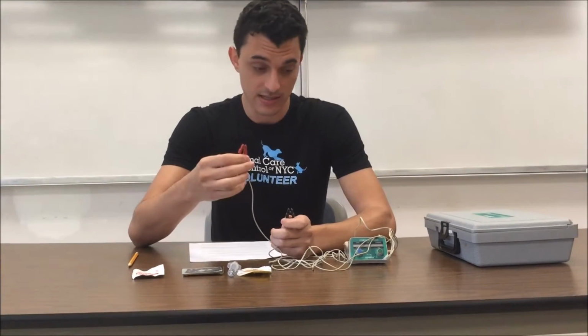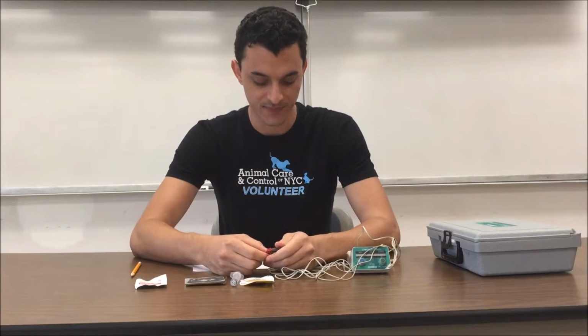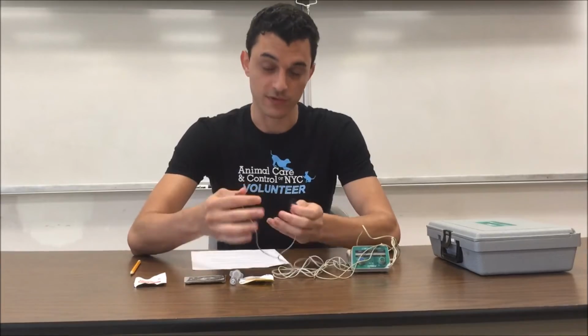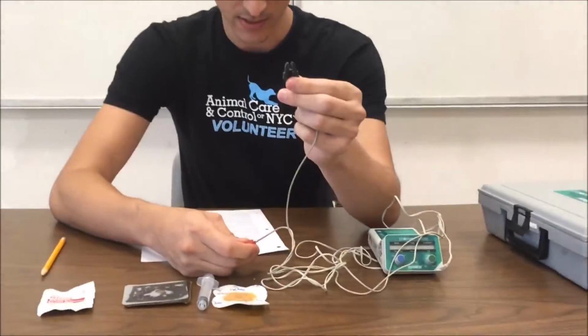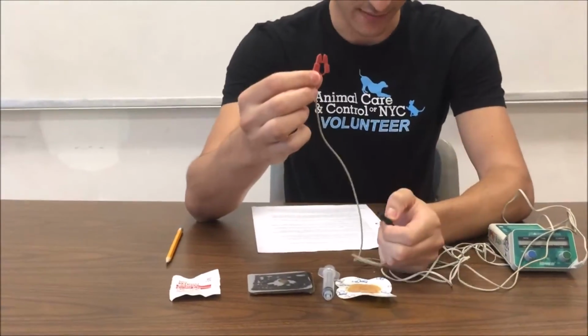Now, although many substances are delivered via iontophoresis, the two most common substances we see are dexamethasone and lidocaine. Dexamethasone is basically a corticosteroid with anti-inflammatory effects that treats conditions like bursitis or tendinitis, while lidocaine is a local anesthetic used before surgery. Now, dexamethasone carries a negative charge. So if we were to deliver it via iontophoresis, we would use this black electrode here. If we wanted to deliver lidocaine, we would utilize the red electrode here.